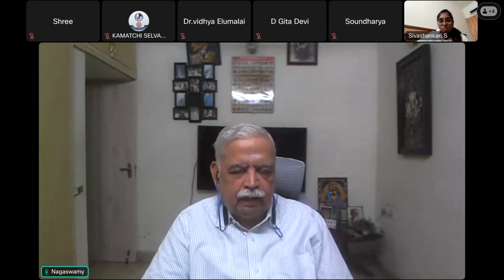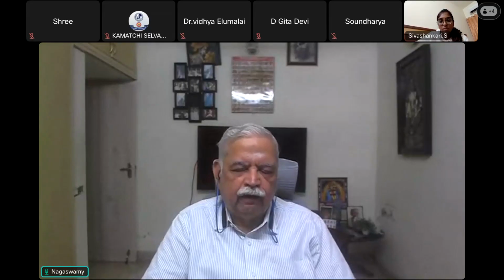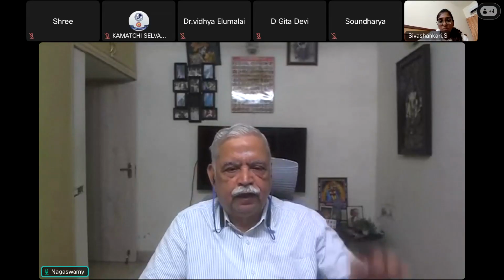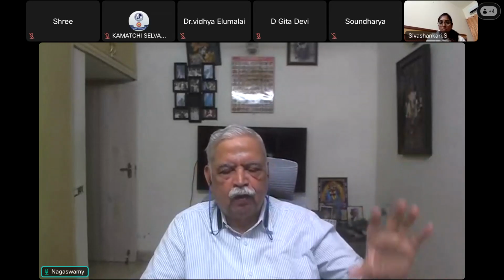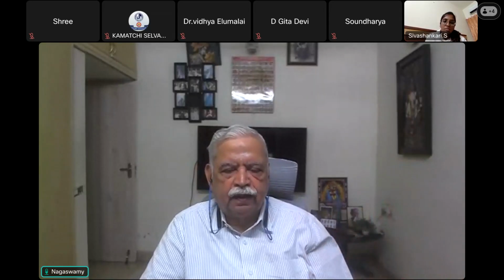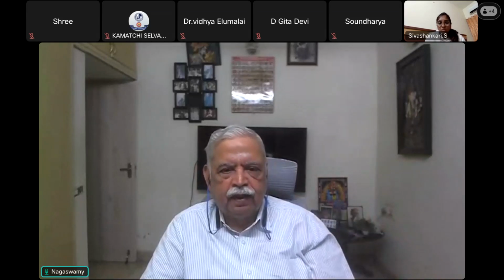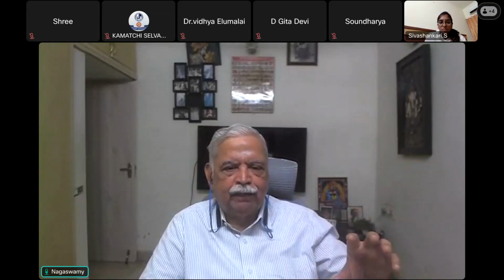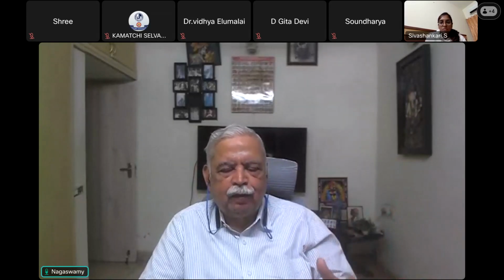So this can be done by what is called volume cycled or volume delivered mode of ventilation, where whatever be the changes in the patient, if you set a 500 ml tidal volume, come what may, that 500 ml will be delivered to the patient. This is called volume controlled ventilation. The other mode is called pressure controlled ventilation, where at a particular pressure, the gas will be delivered to the patient, but the volume will not be guaranteed. If you set 500 at one time, it may deliver 600 or 650. Another time, it may deliver just 350, depending upon two factors.